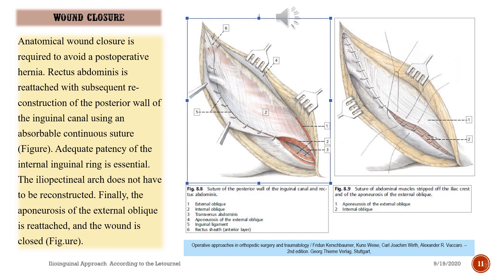Wound closure: anatomical wound closure is required to avoid a postoperative hernia. Rectus abdominis is reattached with subsequent reconstruction of the posterior wall of the inguinal canal using an absorbable continuous suture. Adequate patency of the internal inguinal ring is essential. The iliopectineal arch does not have to be reconstructed. Finally, the aponeurosis of the external oblique is reattached and the wound is closed.